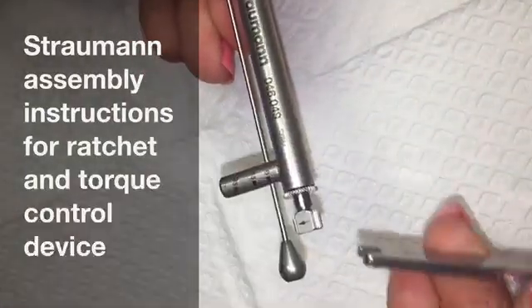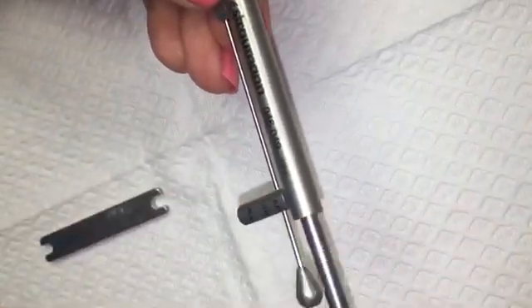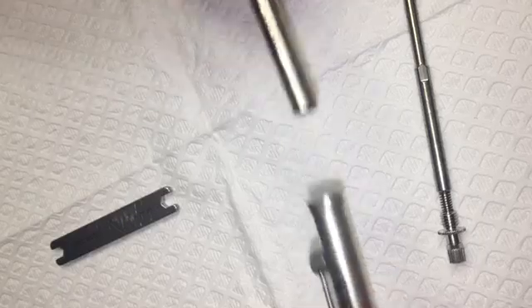Loosen ratchet nut with service instrument or holding key. Unscrew and remove internal bolt from ratchet body.